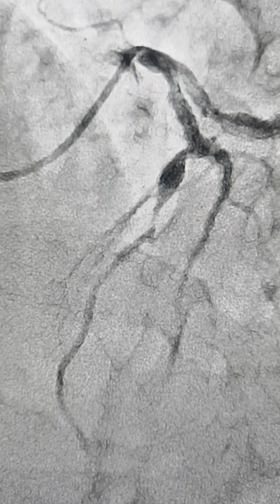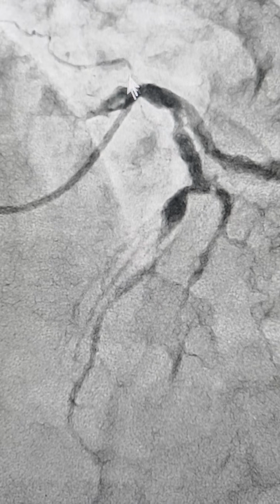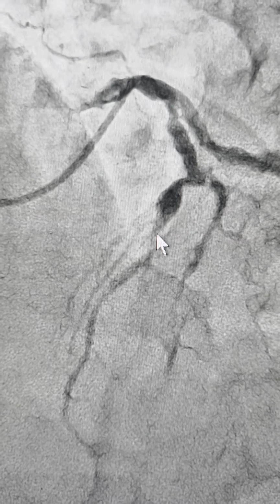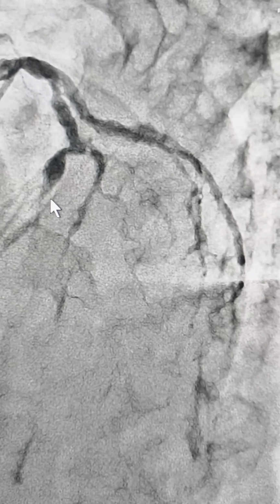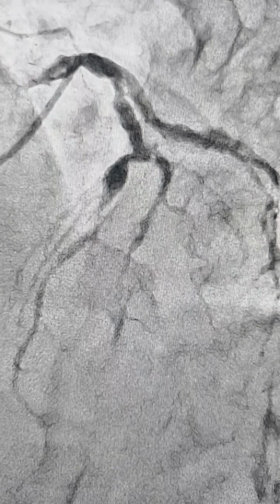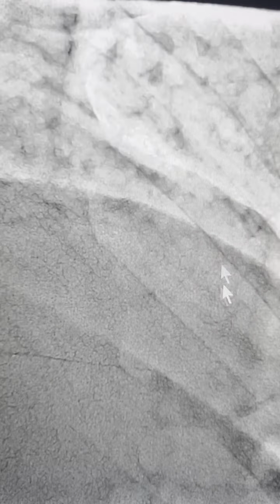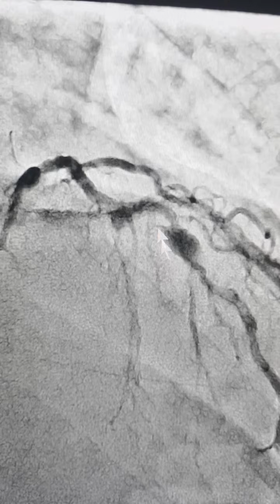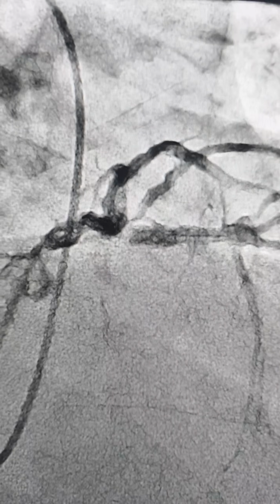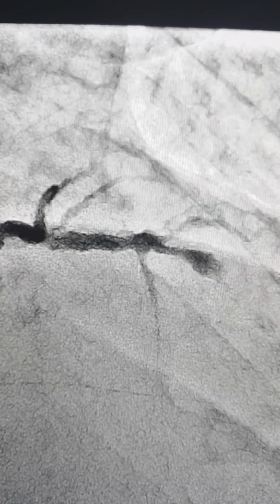The left main was not that narrowed, and we thought there was enough reflux and there wasn't much narrowing. There was some proximal narrowing here, a little bit of plaque there, which we thought may be significant, and a severe narrowing here. The circumflex system was relatively okay. So this was his angiogram, and we took a couple of other views also, just to confirm what we were debating. So two narrowings, mid to distal LAD, nothing severe in the proximal part, and the left main, which was nothing to write home about except for a plaque.